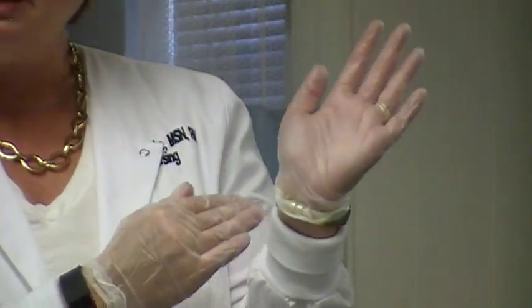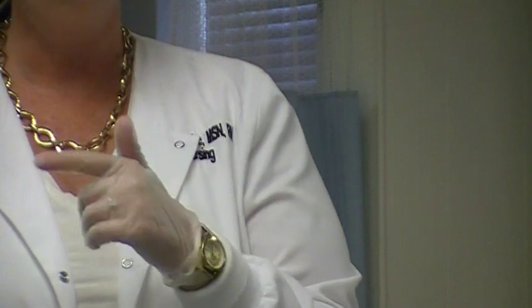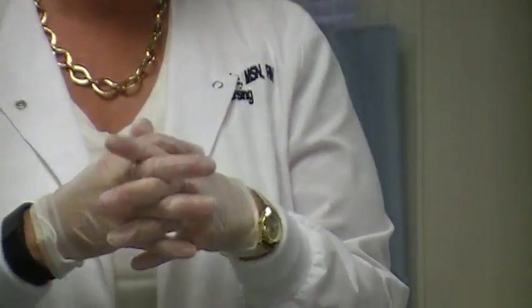Don't worry about this underneath here. That part's not going to be touching anything that's sterile, and sometimes when we try to correct that, we end up contaminating our gloves. As soon as I get my sterile gloves on, one of the very first things I do is clasp them together, okay?